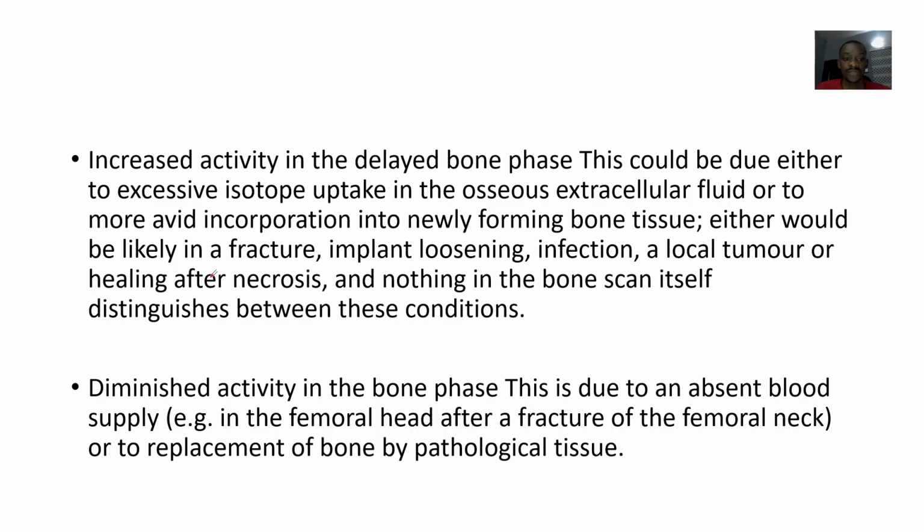Okay, so increased activity in the delayed bone phase. This will be due to either an excessive isotope uptake in the osseous extracellular fluid, or a more avid incorporation into newly formed bone tissue, right? Either of these will likely be a fracture, implant loosening, infections, a local tumor, or healing after necrosis, right? So nothing in the bone scan itself distinguishes between these conditions, right?